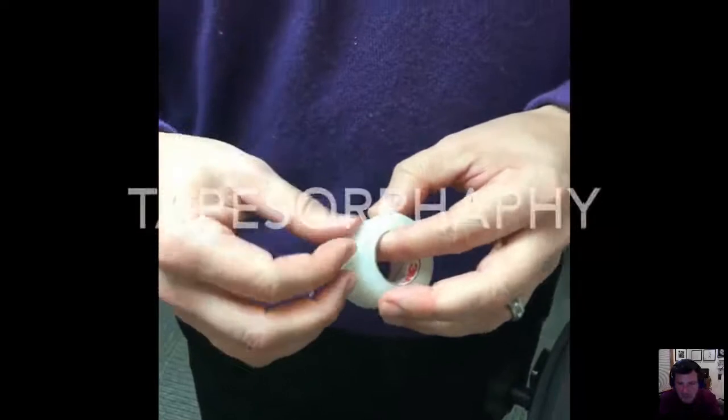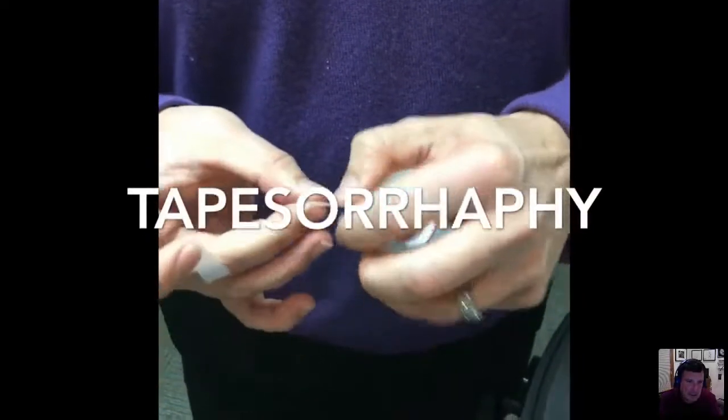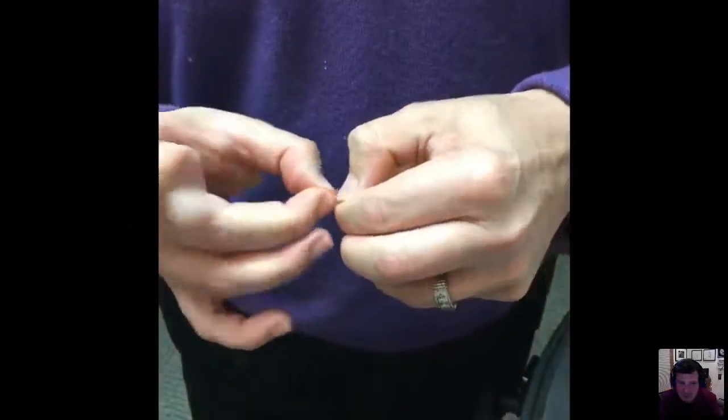And that's as easy as it is to insert. Now what I'm doing is trying to get it to center, and it's on the eye. Obviously, we use proparacaine. So the key was to rinse, put some proparacaine in there, and insert it. Remember, it came from a baby. That placenta stretches. That membrane's not going to break.